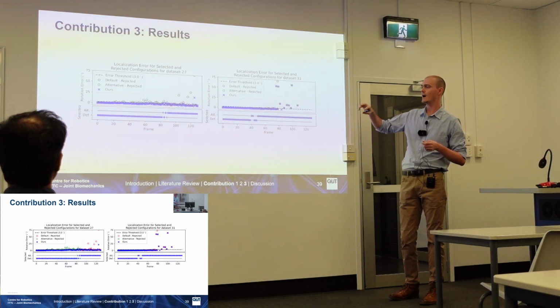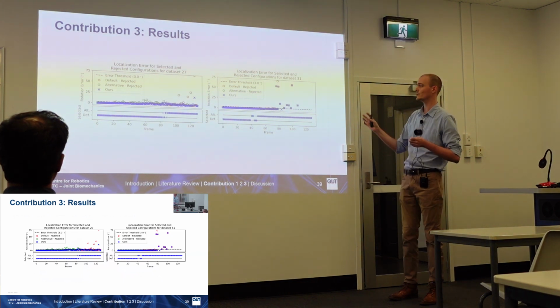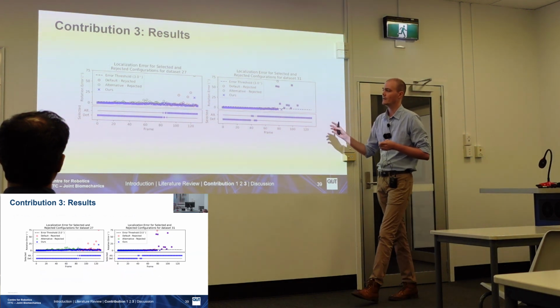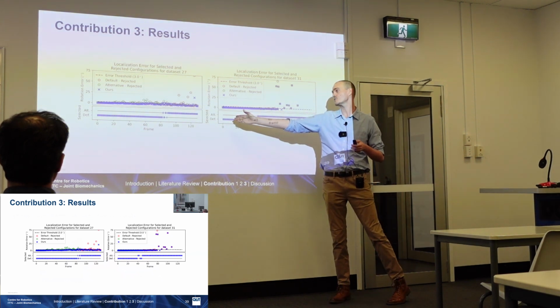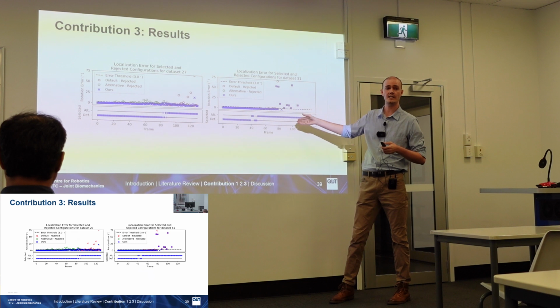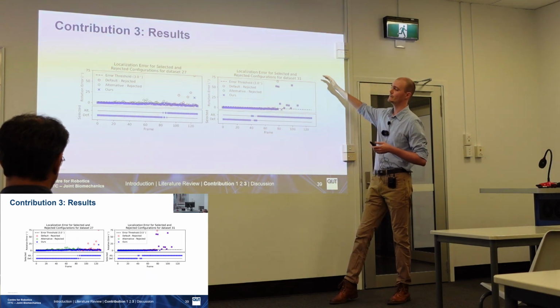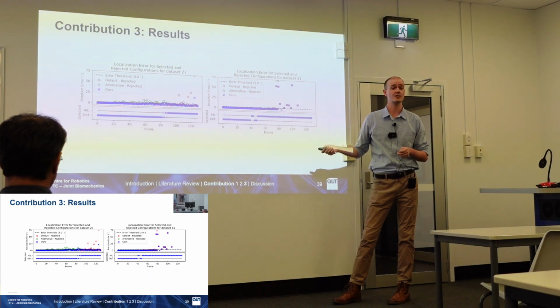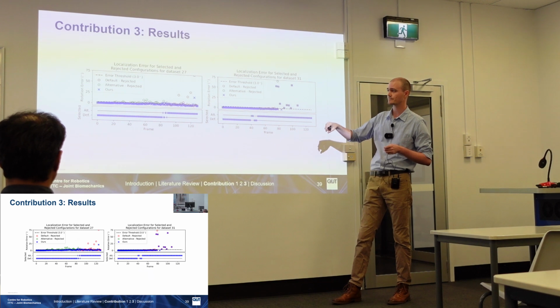And these two plots highlight how our system is able to perform better than the two underlying approaches, and also a key limitation. Each of these plots shows the traverse through our trajectory. So each individual point here is one of our frames from the start of the trajectory to the end. And on our vertical axis, we have our rotation error, with each point representing an individual pose estimate.